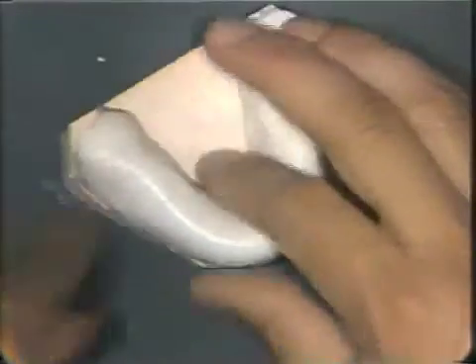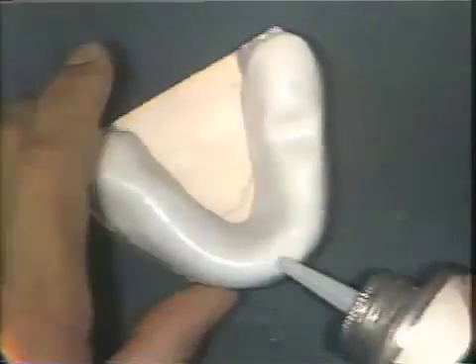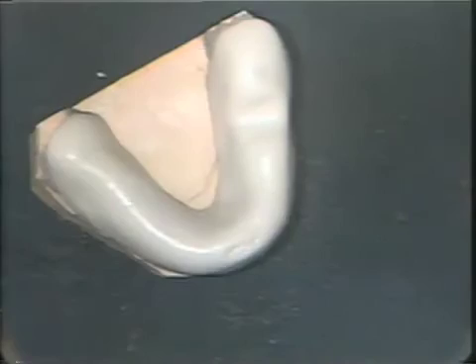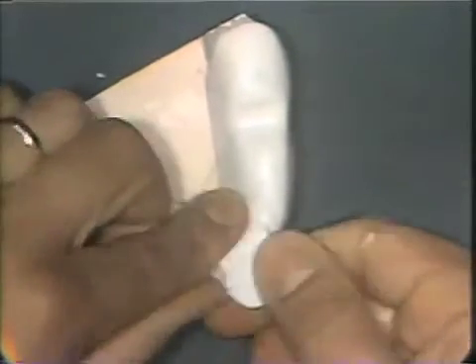The next step is to fashion a handle using the residual material out of the cup. A little monomer is placed in the anterior region of the tray, and from the paper cup a handle is placed in this area.